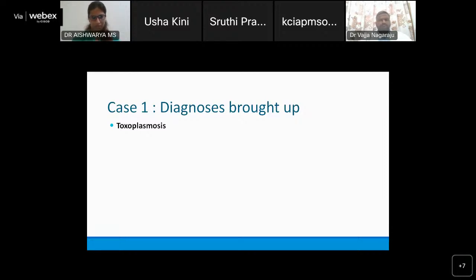Do you think it could be toxo, Aishwarya? No, ma'am. Toxoplasmosis would have some suppurative changes also in the granulomas. What kind of suppuration do you mean? Like an abscess formation. A lot of neutrophils would be there. Yes, there would be nuclear debris. Understand, there would be necrosis, but they will also have granulomata which are small. Yes. And mind you, in your section, it's difficult to find inclusions of toxo.